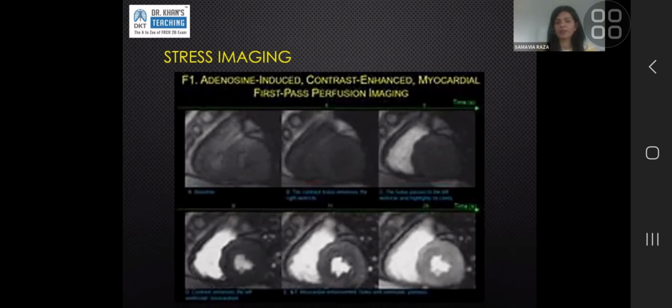If you do it for a while and you're not seeing a response, you just acquire the images anyway, noting that maybe the patient doesn't have symptoms. Sometimes patients with very diseased hearts don't notice adenosine. They don't have those symptoms that a normal person would. The way to explain it to the patients is you may feel that you're suddenly running up 3 flights of stairs. For a young person, it's easy to understand. For an older patient who hasn't run 3 flights of stairs in years, and to have it lying down flat, it can be quite daunting.